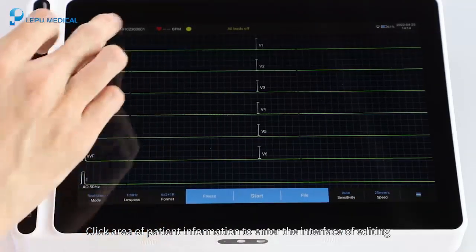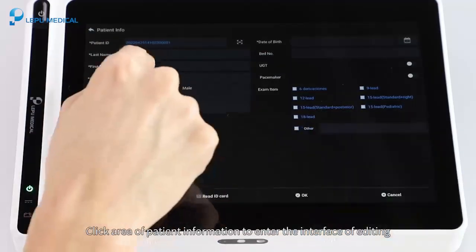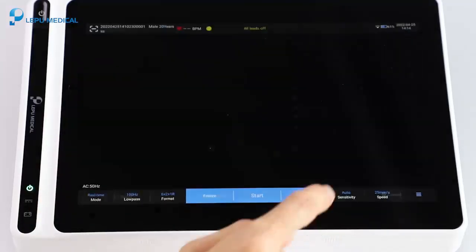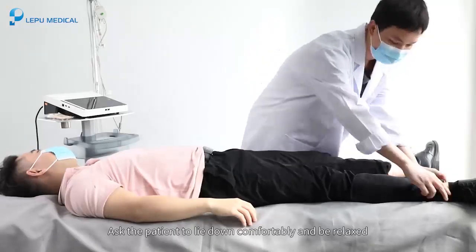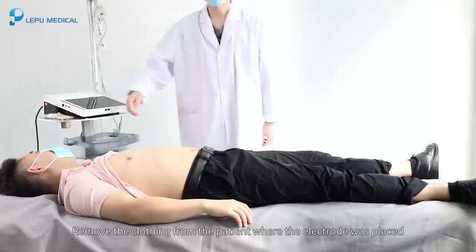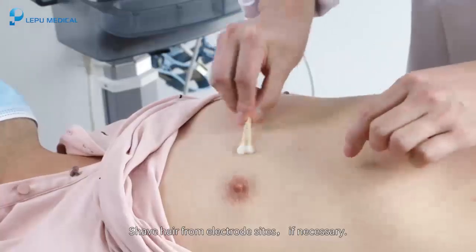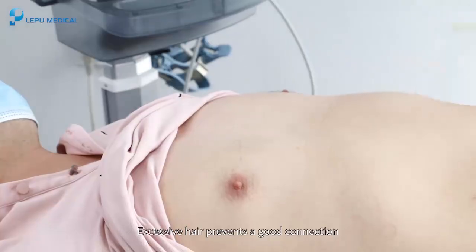Click the patient information area on the main interface to enter the editing interface. Input the required patient information and click OK to save. Ask the patient to lie down comfortably and relax. Remove clothing from areas where electrodes will be placed. Clean the skin with alcohol and shave hair from electrode sites if necessary, as excessive hair prevents a good connection.